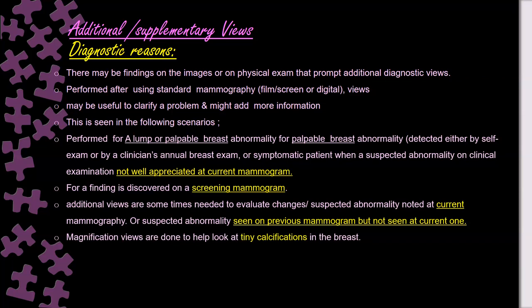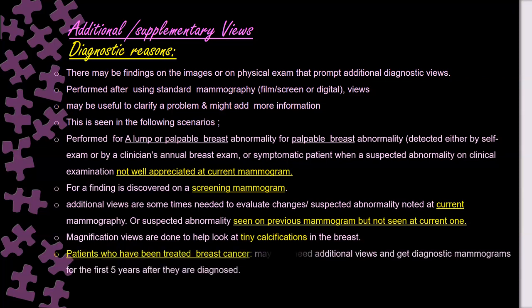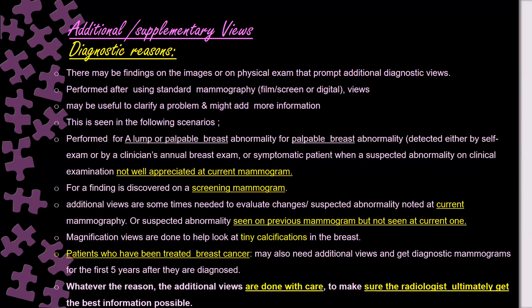Magnifications are done to help look at tiny calcifications, as you know, and for other reasons, characterization of small lesions, for example its margin, or for asymmetry to make sure it is just superimposed tissue or a real asymmetry. Patients who have been treated for breast cancer may also need additional supplementary views and diagnostic mammography for the following 5 years after diagnosis. Whatever the reasons, the additional views are done with care to make sure the radiologist ultimately gets the best information possible.